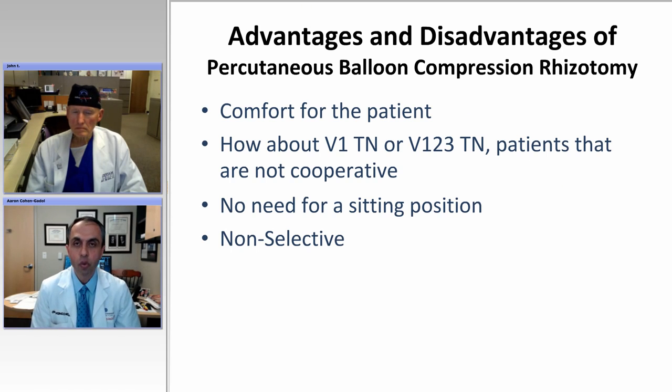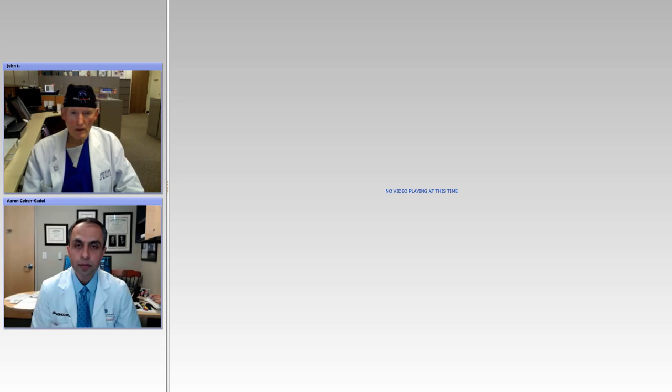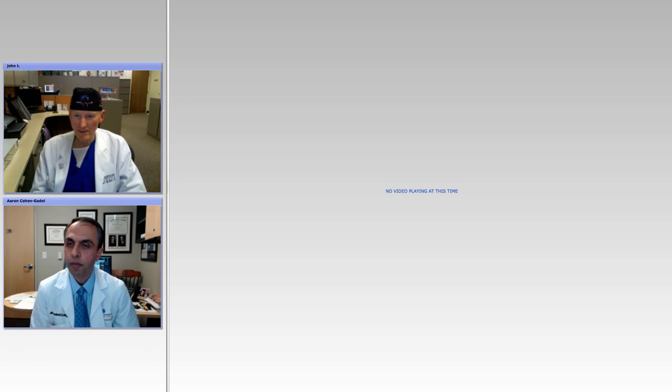Do you have any comments before we go to the video, Dr. Chu? No, I agree with your approach, except I only use the lateral fluoroscopy. And using those techniques that I described, it's very easy to get into the foramen. And also in this medial anterior part. But obviously, I have a lot of experience. So if the individual feels more confident using an oblique view with the fluoroscopy, I think it's perfectly okay. I certainly don't think you need to use a stereotactic system or an MRI like some people have recommended. Yeah, I agree.